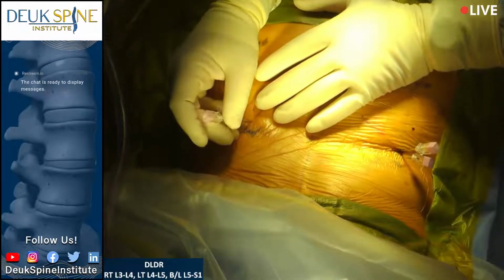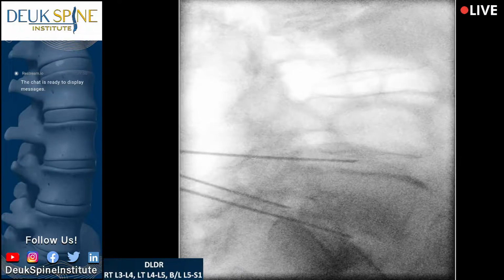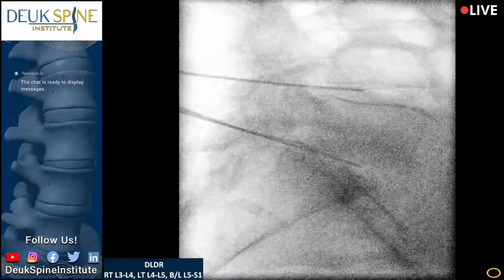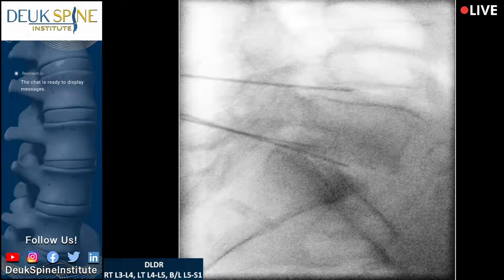Not really happy with that. I'm going to try to come down again. Shot? You're okay. Can you get that pedicle lined up as best you can? I want to see that 5-1 disc. I think you went too far north. I may have to finesse this one. Yeah, it just keeps deflecting up. Let's get an AP.